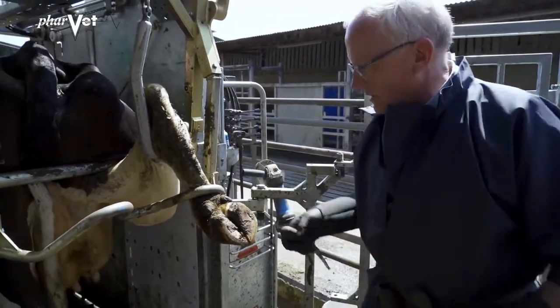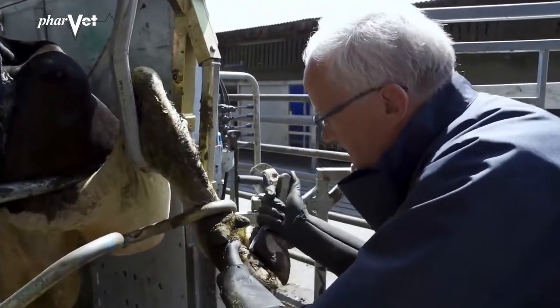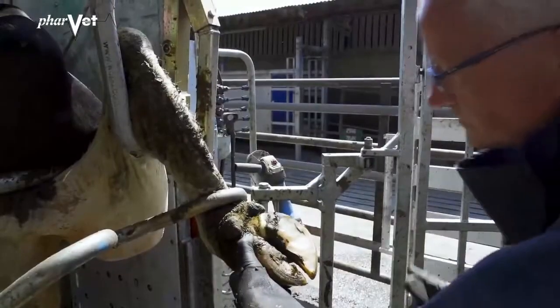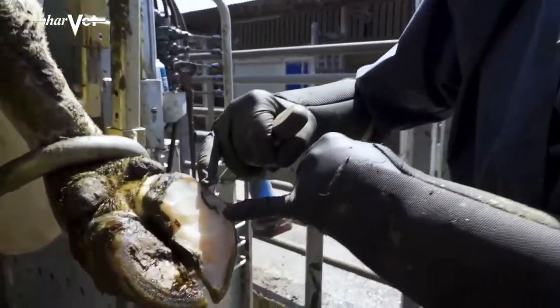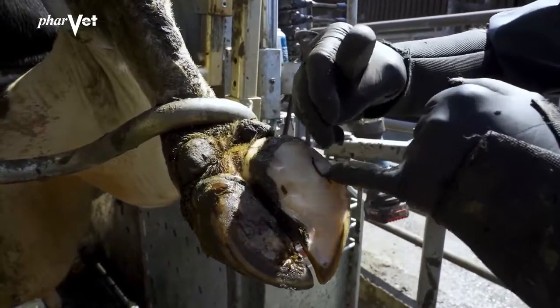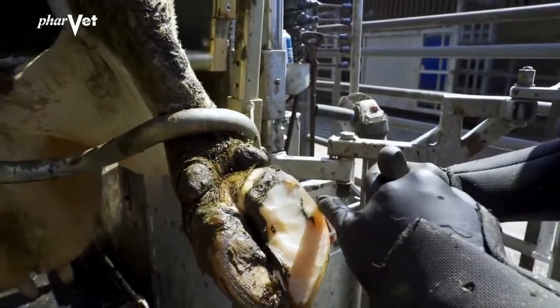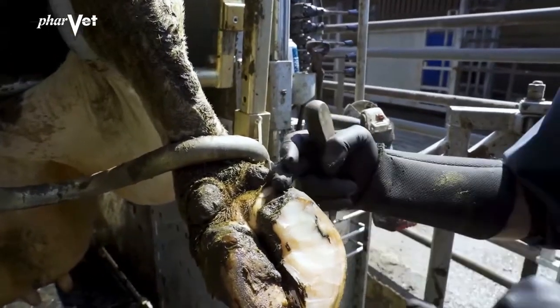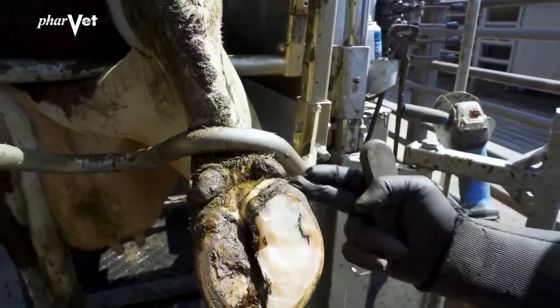So I'll just take off some of this heel here. Now you'll see this black area here — this is a typical white line lesion. What has happened here is that dirt and grit has gotten through here, which is one of the softest parts of the sole, and it has tracked up along here inside the hoof wall and broken out at the top where the hoof wall gets close to the hairline.